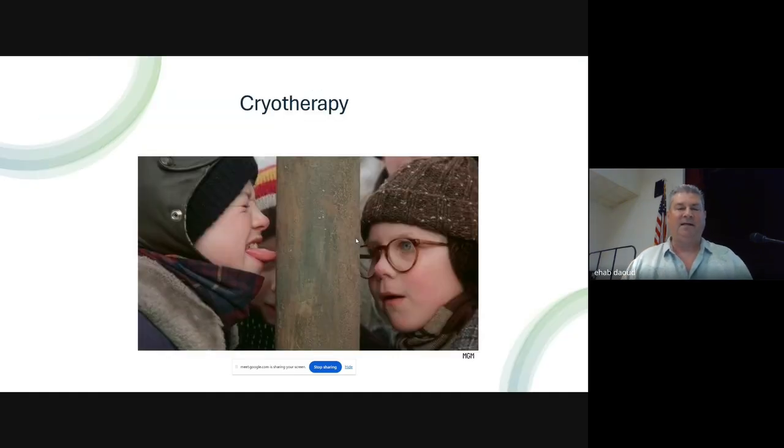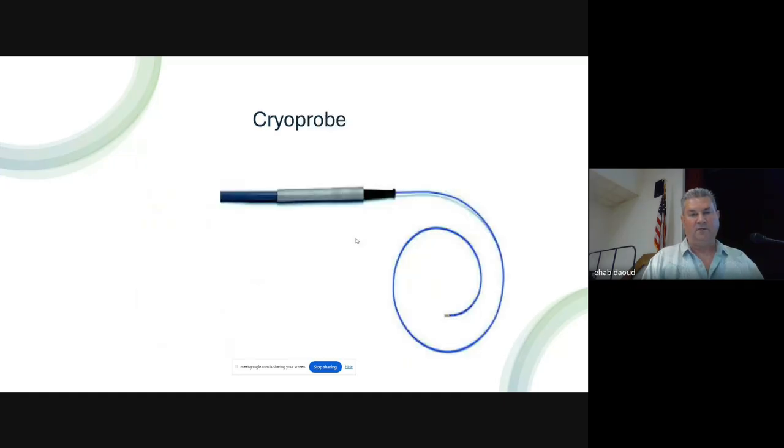Cryotherapy. So this is the idea with cryo. You're using the tip of your catheter to freeze to whatever it is you're trying to remove, be that tumor tissue or something you just ablated, or a foreign body if it's organic. Cryo doesn't always work in certain situations. But the beauty of cryo is it doesn't matter if the patient's on FiO2 100%. So we can use lots of cryo when they're really sick. This is what a cryo probe looks like.